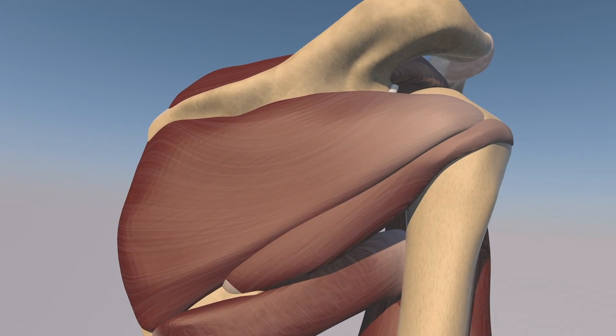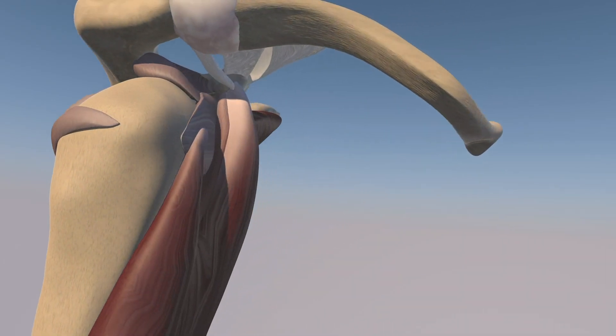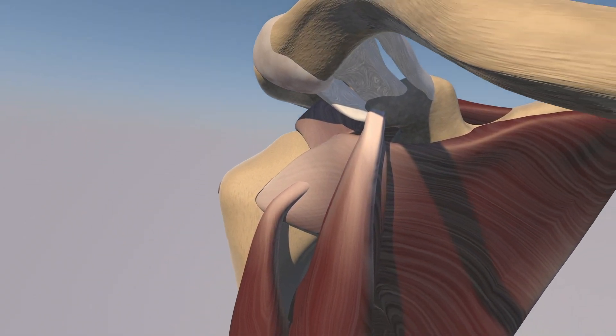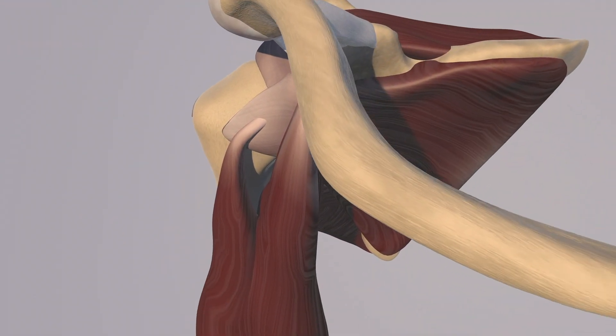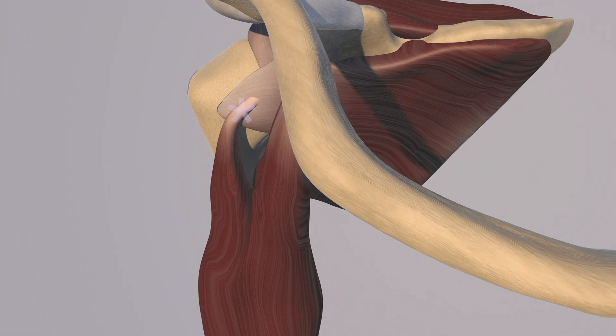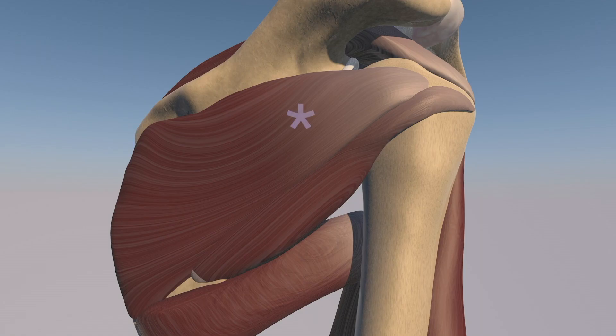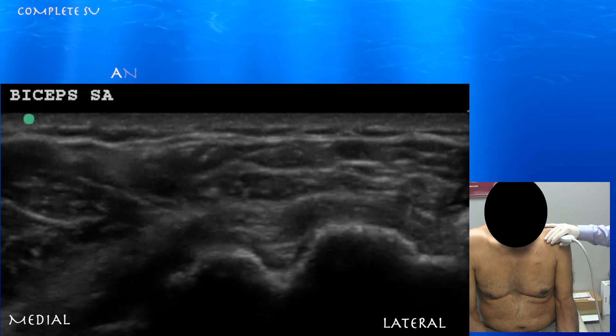Here we are just wrapping around again. We can see the posterior component of the shoulder — no supraspinatus tendon visible. You can see this full thickness tear of the subscapularis tendon as well as medial subluxation of the biceps tendon. There is also significant retraction of the supraspinatus tendon, with some but less significant retraction of the subscapularis and infraspinatus tendons. Significant atrophy of the supraspinatus, infraspinatus, and subscapularis musculature is also appreciated.